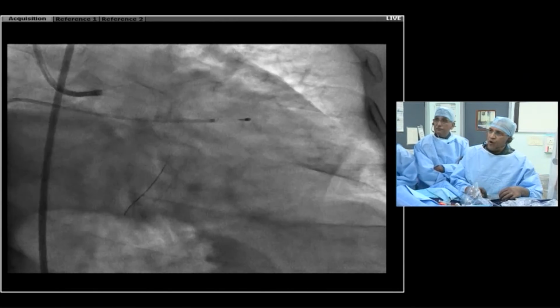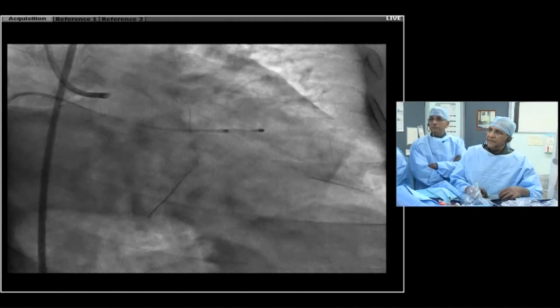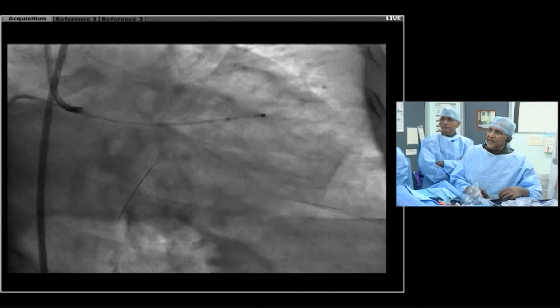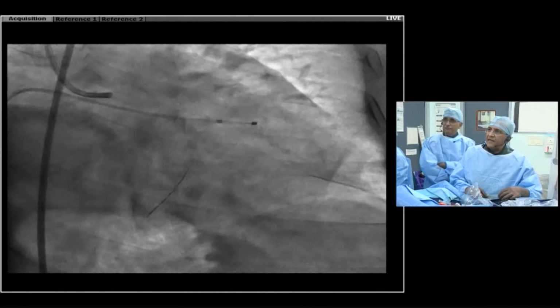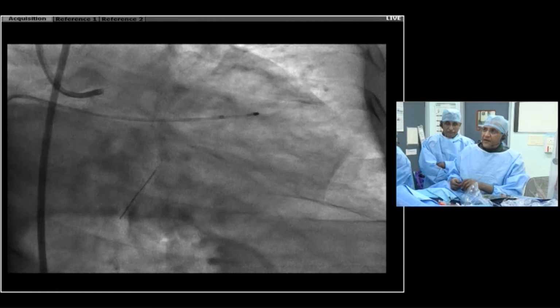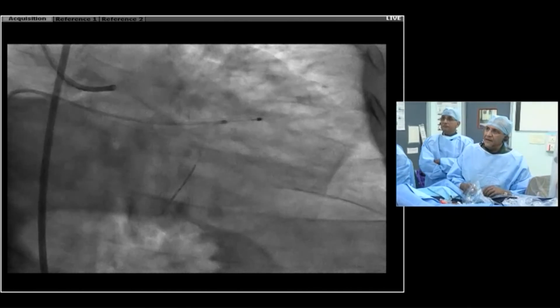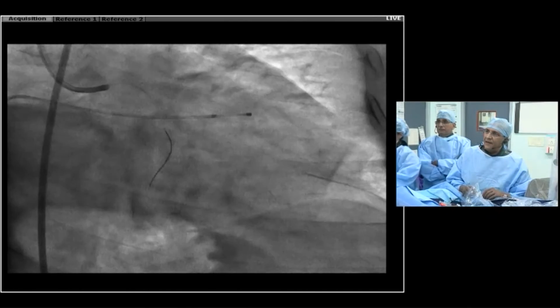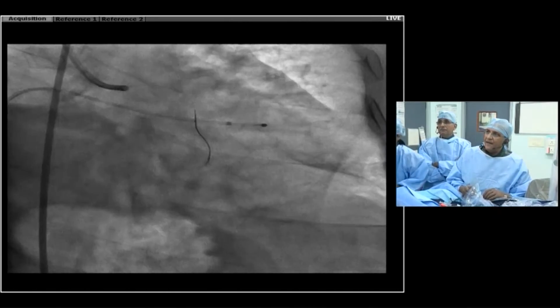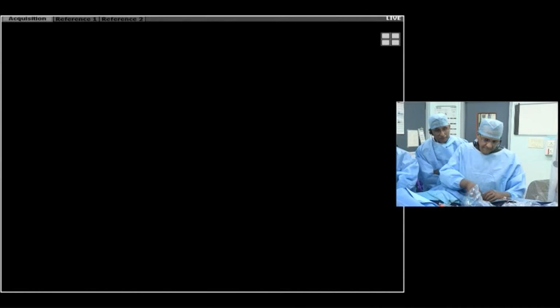I do an anti-clockwise on the microcatheter a little bit, and it will slowly negotiate these kind of lesions. But if it doesn't, I'm not going to push it because I'll show you what happens to the tip of the microcatheter when you do that. Yeah, especially in super calcified lesions, you can leave the tip of the catheter behind. So just be cautious. And for this, you just need to get it to where it needs to go and then make a bigger bend on the wire.